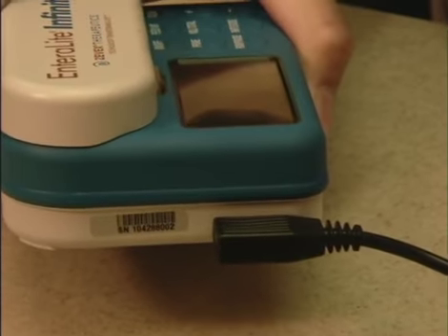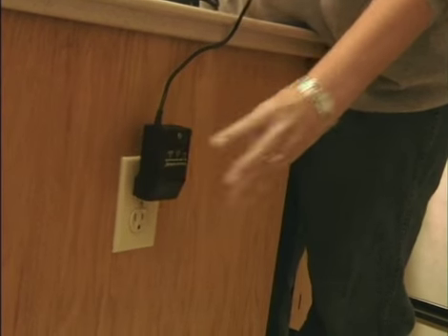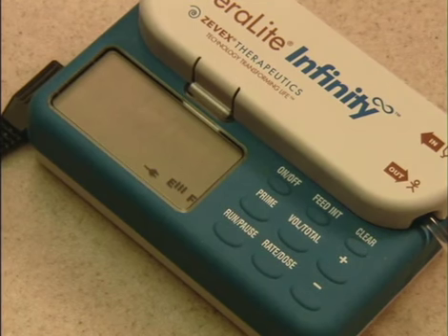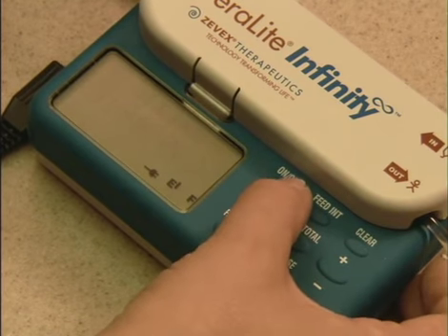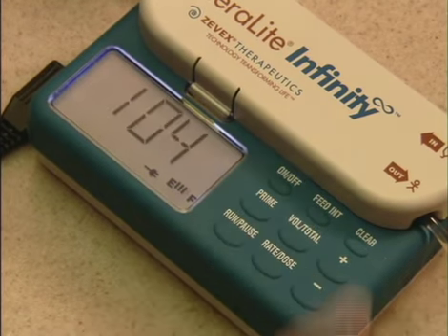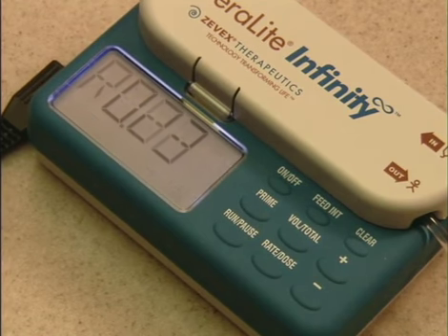Charging the battery is easy. Plug the AC adapter charger into the port on the left side of the pump and plug the charger into the wall. The plug symbol will appear on the display when the pump is plugged in, and the bars in the fuel gauge will scroll from E to F, showing that the battery is being charged.